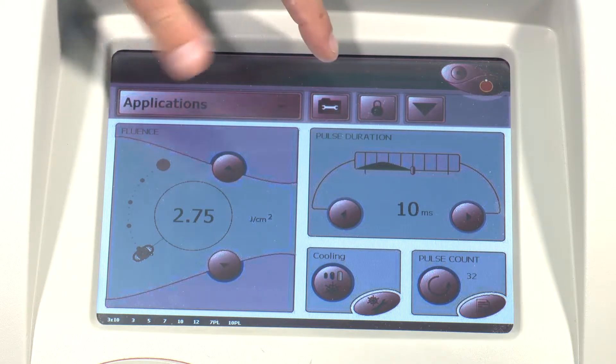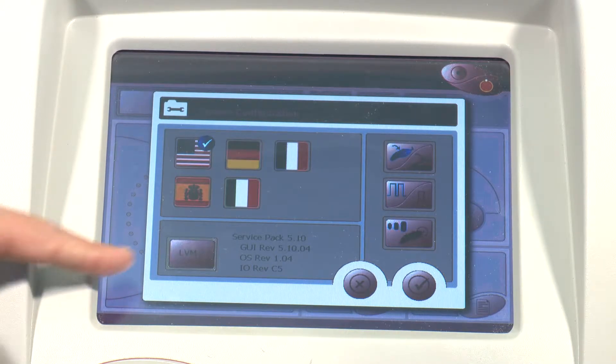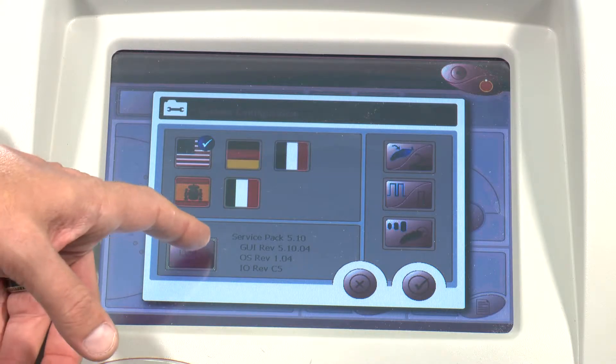Here we'll go to the settings screen. On the settings screen you'll see the software that's loaded onto the device. Then from here we'll go to the LVM screen.